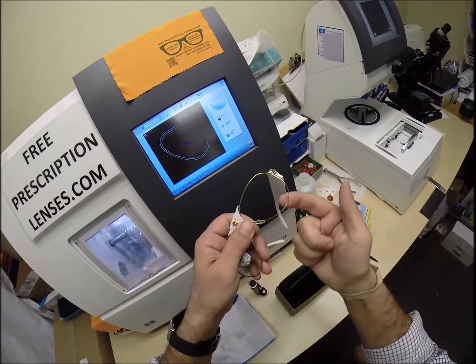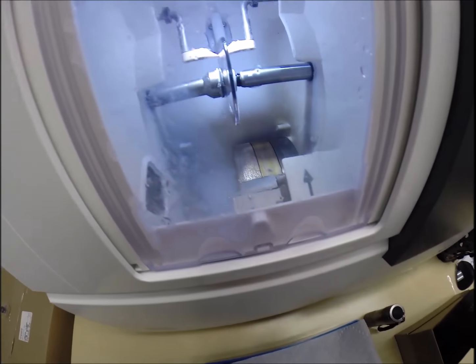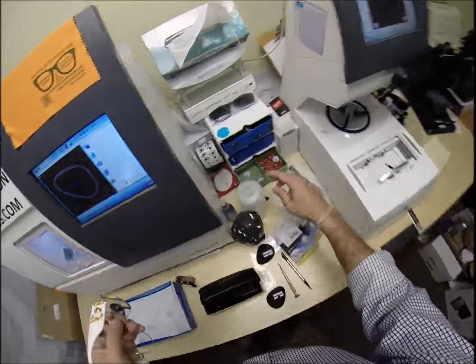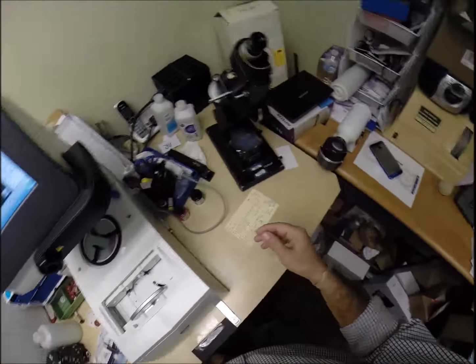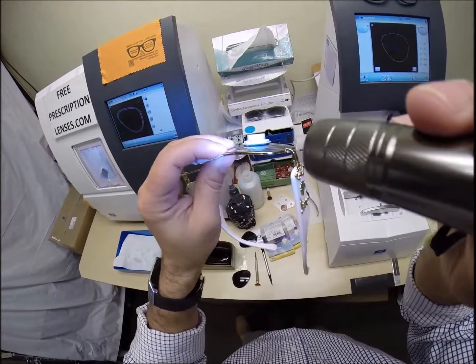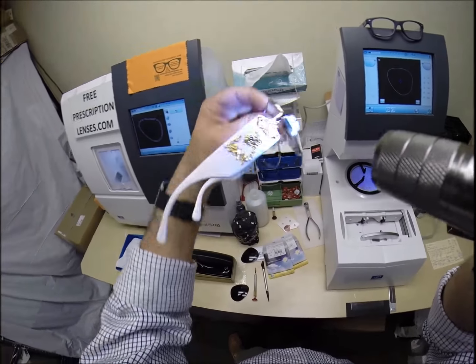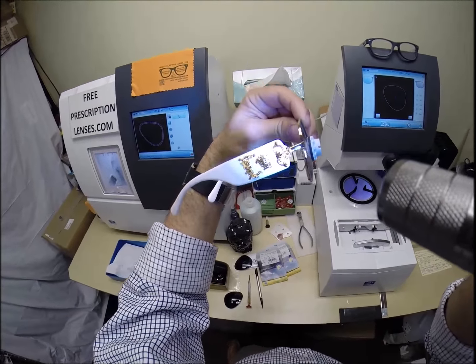But you can see as it's going around, tracing the shape of the lens. And just like before, it's measuring the thickness of the lens at every point to know exactly where to place the bevel, so you have the least amount of edge thickness showing. And if I could find my flashlight, oh, it was over here the whole time. No edge thickness whatsoever. How about that? That is looking good.